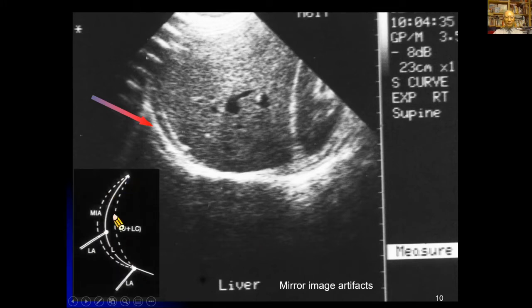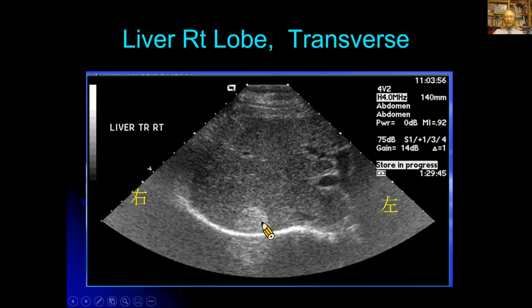So this is the diaphragmatic presentation. And here, scanning the liver right lobe, you can see a hyperechoic structure. It is most likely a hemangioma, but here you can see another one. Actually, this is not a real one. There's a reflection from this real structure, so there's a pseudo hemangioma above the hyperreflector here. That's the visceral pleura or lung.